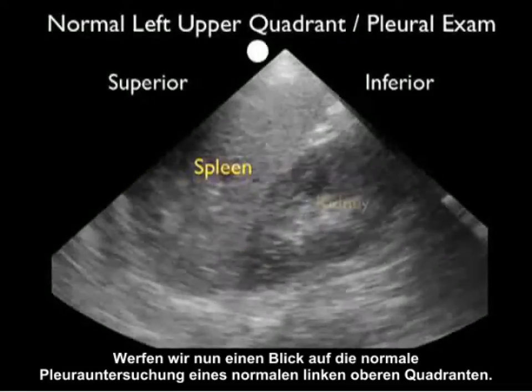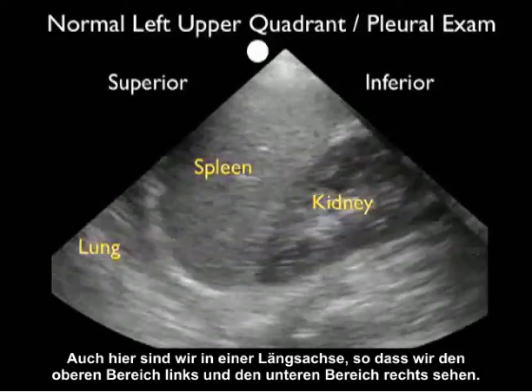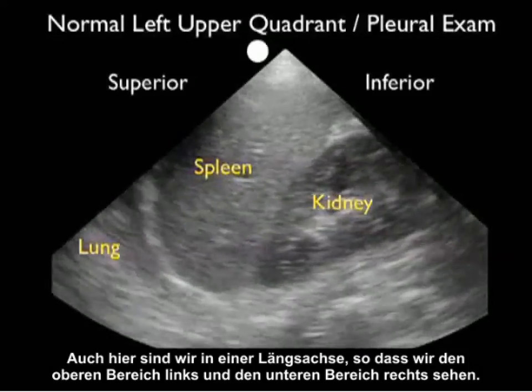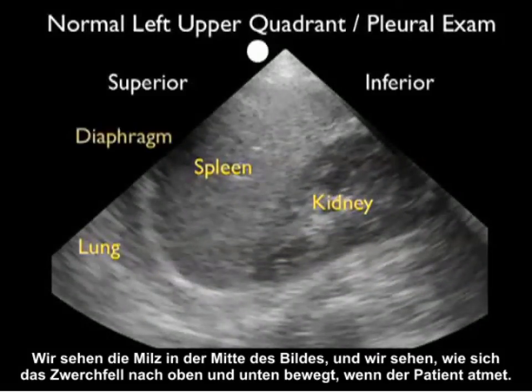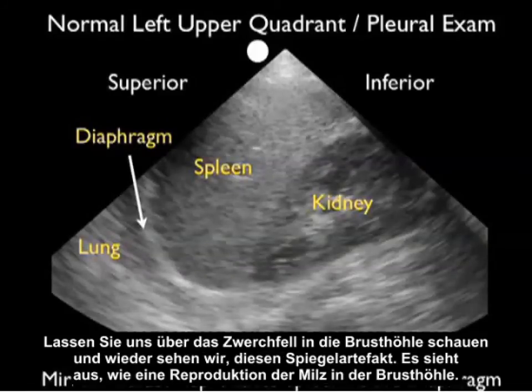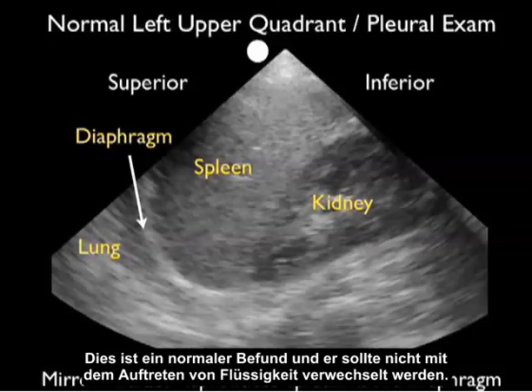Now let's take a look at a normal left upper quadrant pleural exam. Again we're in a long axis configuration, so superior to the left, inferior to the right. We see the spleen in the middle of the image and the diaphragm moving up and down as the patient breathes. Looking above the diaphragm into the thoracic cavity, we again see that mirror artifact — almost like a reproduction of the spleen within the thoracic cavity. This is a normal finding and not to be confused with fluid.